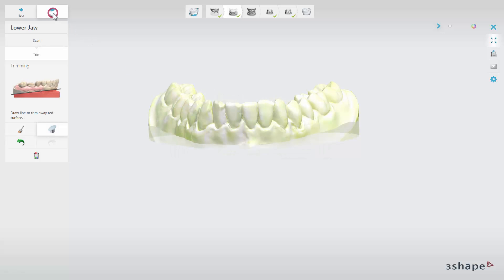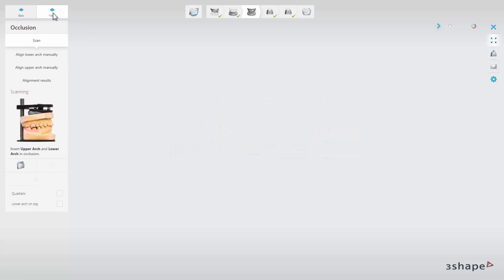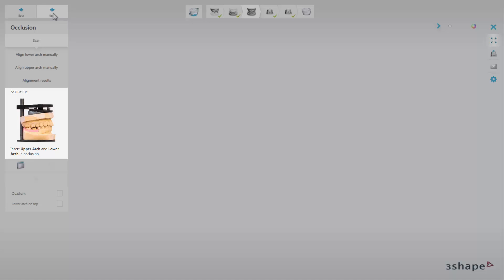After clicking on Next, the software will ask you to insert the upper and lower models in the occlusion, if you did not decide to skip the bite by using one of the two available methods. Here you can select the relevant option if you are scanning only quadrants or when the lower model is on the top.